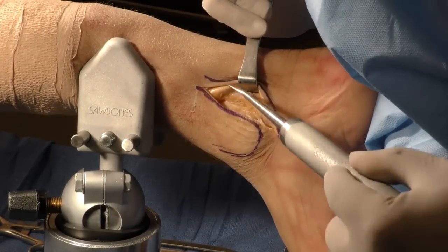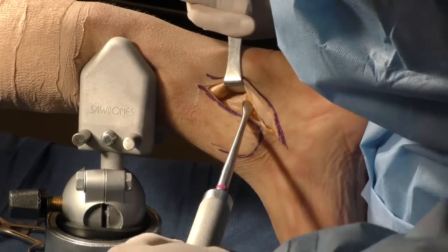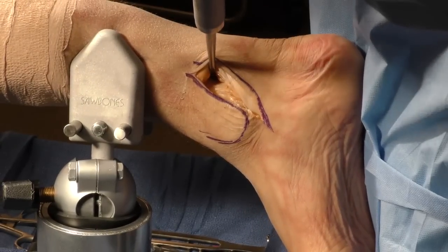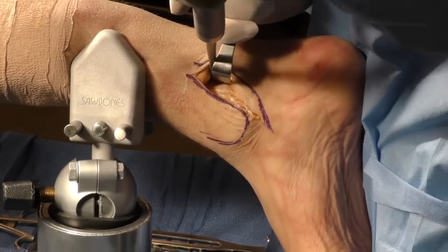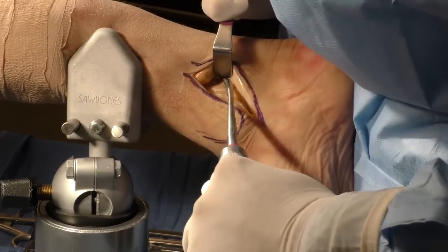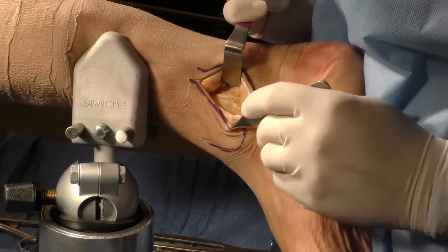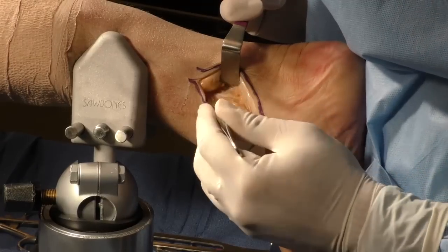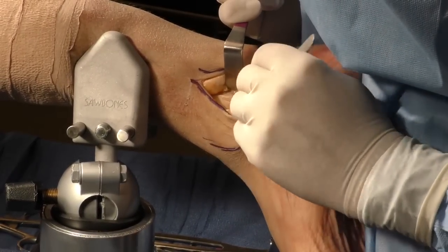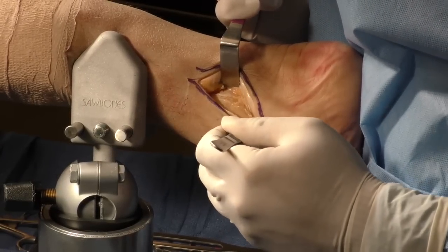Here's the posteromedial tibia. The plate, which I'll demonstrate in a minute on the other cadaver, goes right on this posterior tibial border and will fit within this tibial groove. It's been designed for these posterior pylon and malleolar fractures to sit right within the groove, and you can easily plate without having to worry about the neurovascular bundle at all. The posterior tibial tendon will sit nicely back in the groove, and during closure you can easily close the posterior tibial tendon sheath to decrease the risk of subluxation. And that's the easiest way to approach the posteromedial malleolar fracture.